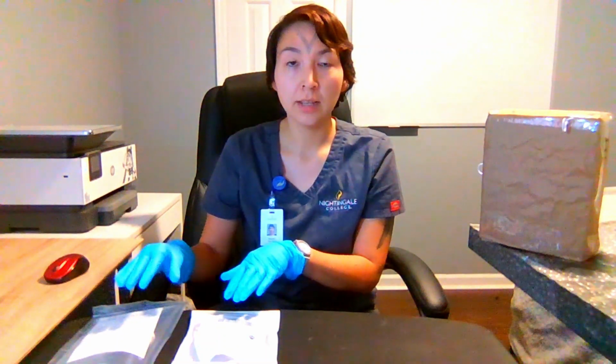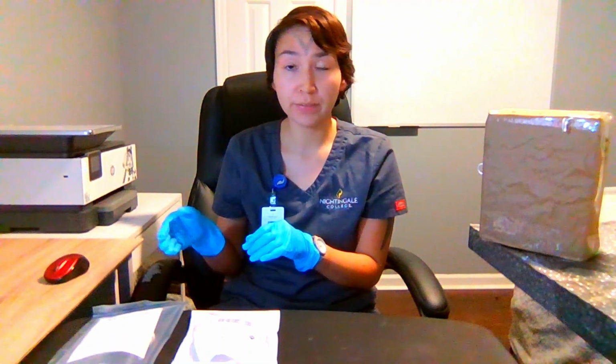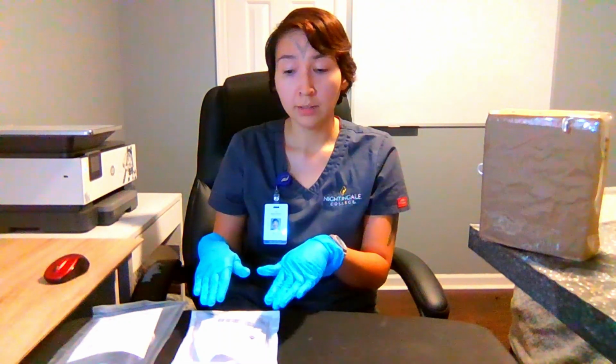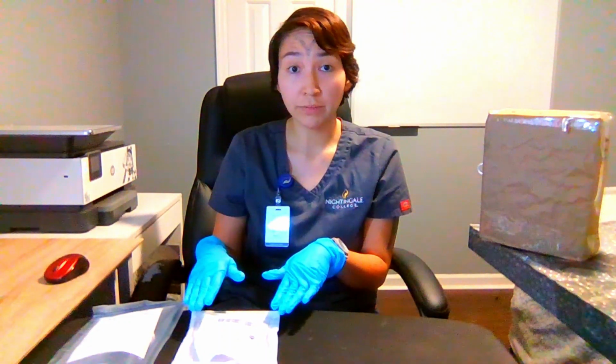Next, I'll review all the parts of the IV tubing. I have 2 sets. They are both macro tubing. Macro tubing typically delivers a 10 or 15 drop factor per ml, depending on the manufacturer, and it's used to deliver rates greater than 100 ml per hour. For my primary tubing, it is labeled a drop factor of 15.